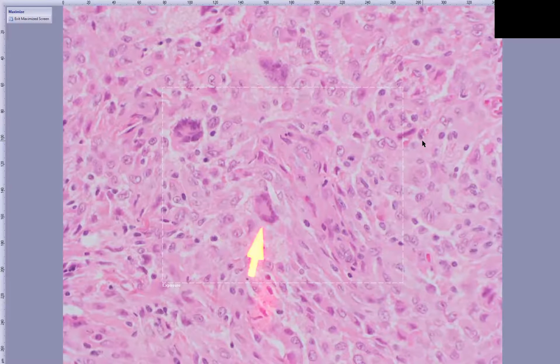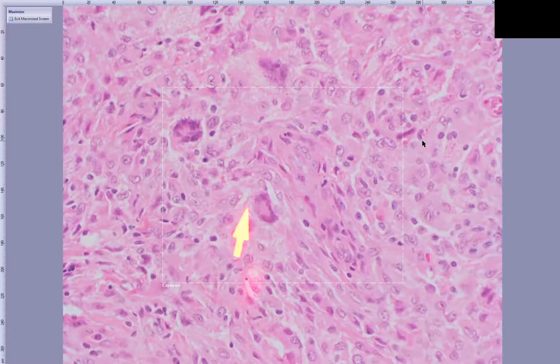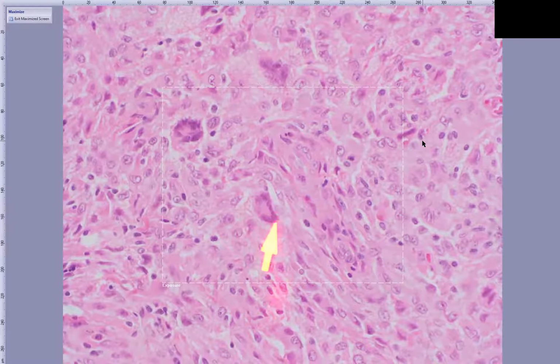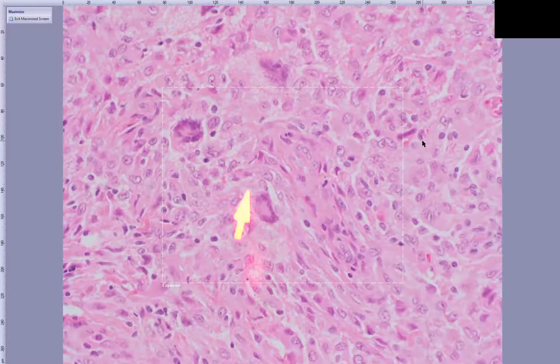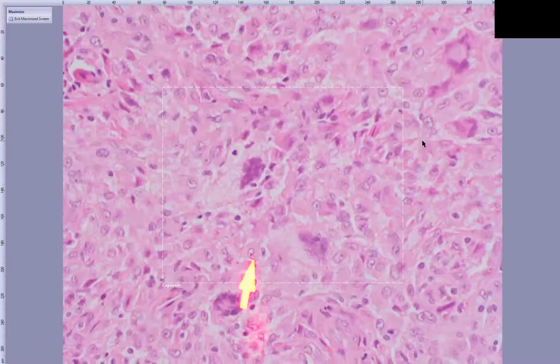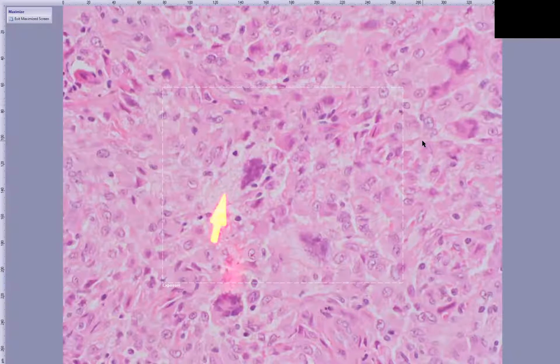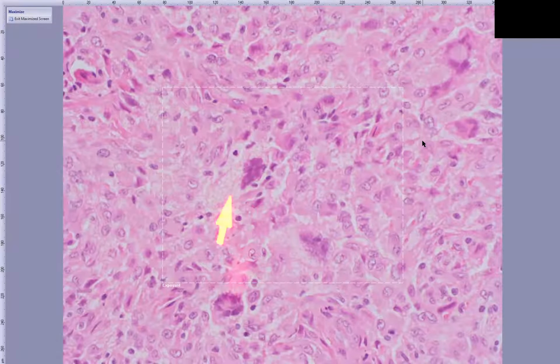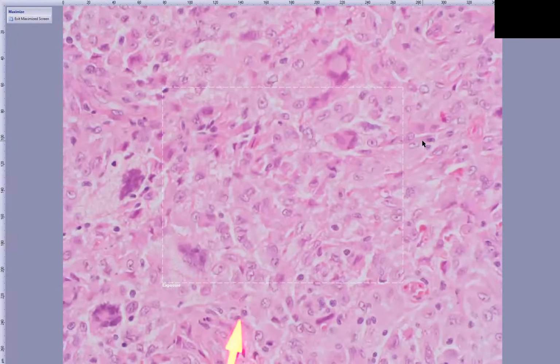And then at the outer part of the cell, you have a foaminess to the cytoplasm that either is observable around the entire circumference of the multinucleated giant cell, depending on how it's sectioned. For instance, in this example, you can see the foaminess extends pretty much around that multinucleated giant cell, or you might just see it on one side of the cell.